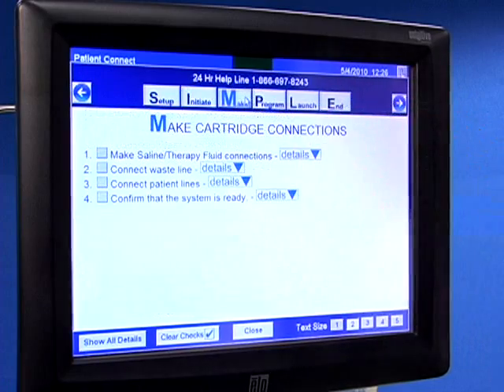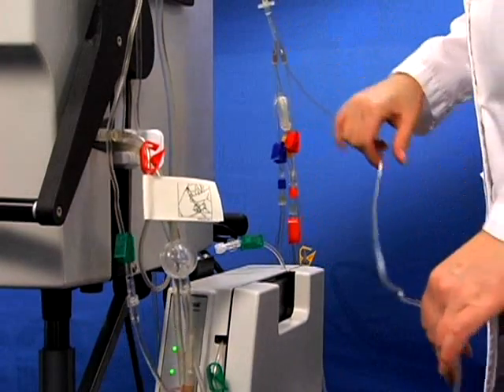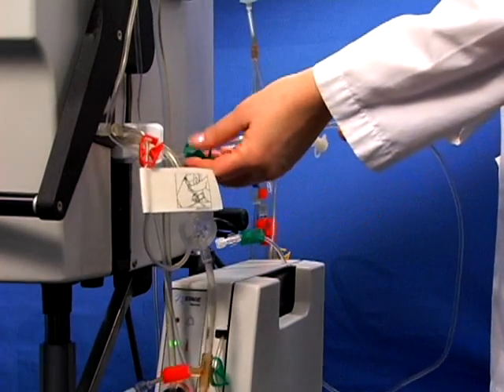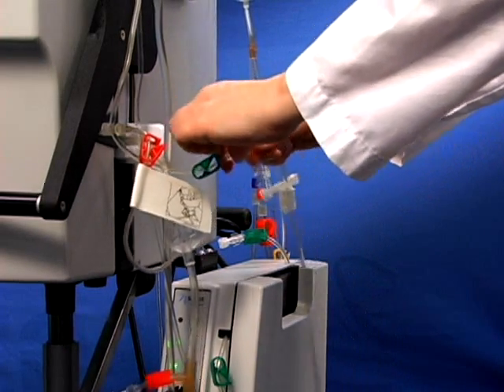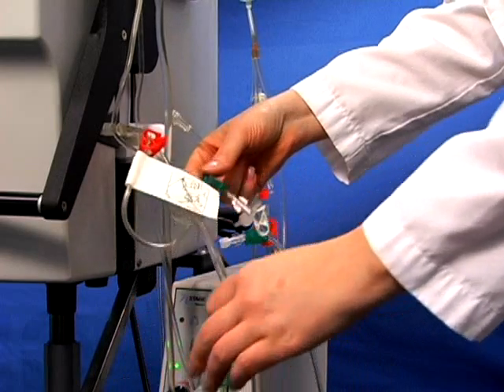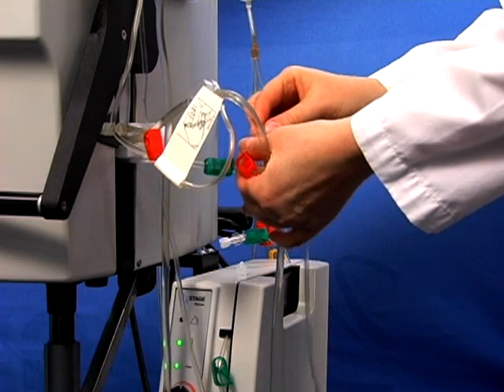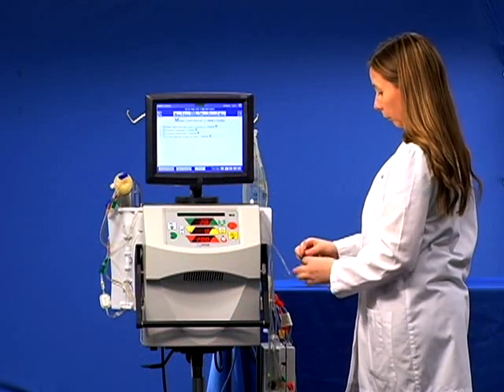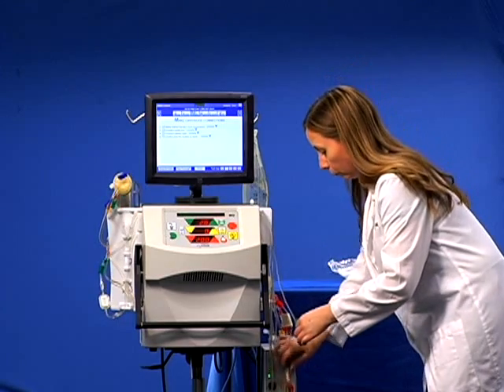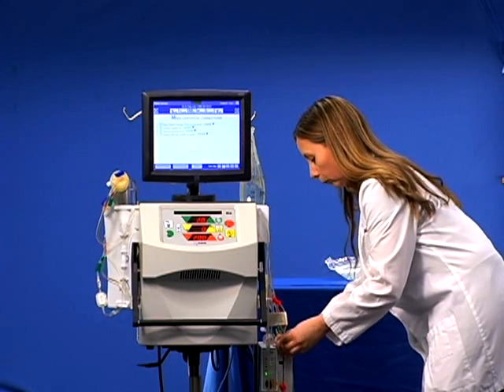You can now move to make cartridge connections. Locate the start of the saline line and follow the line to the white and green clamps. Clamp the saline line and clamp the therapy fluid inlet line, then disconnect. Make sure to keep the connection sterile. Attach the saline line to the saline T. Do not unclamp. Connect the therapy fluid inlet line to the warmer outlet, or the therapy fluid tubing if not using the warmer, and unclamp.